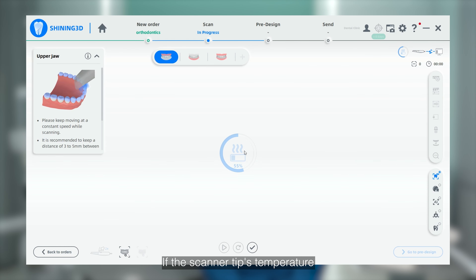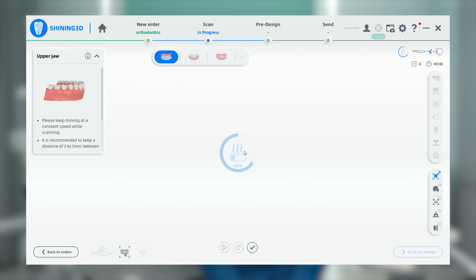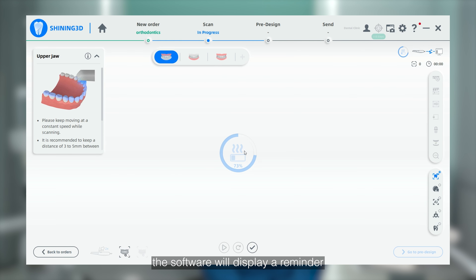If the scanner tips temperature is lower than the anti-fogging setting, the software will display a reminder regarding the heating process. Once the reminder disappears, the preheating process is complete and the scanner is ready to capture data.